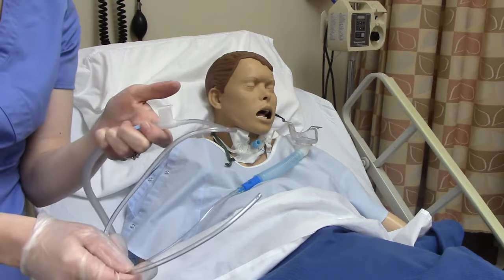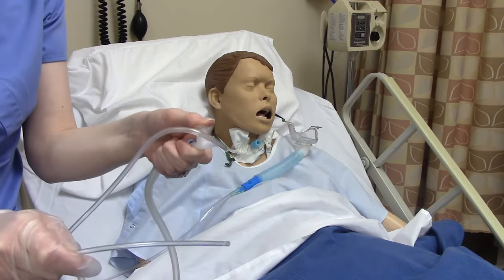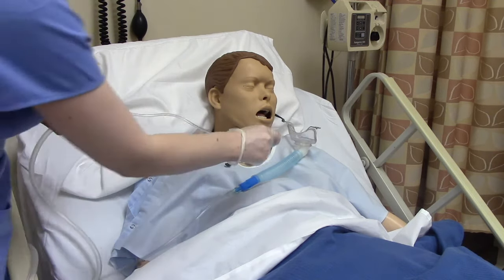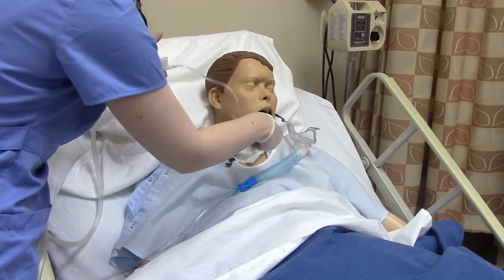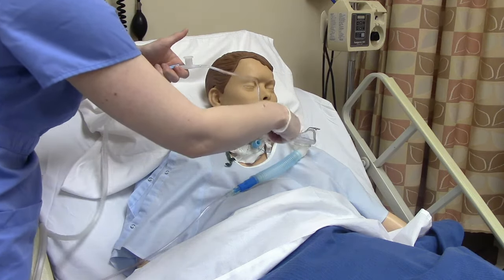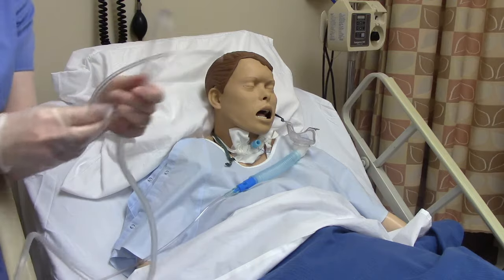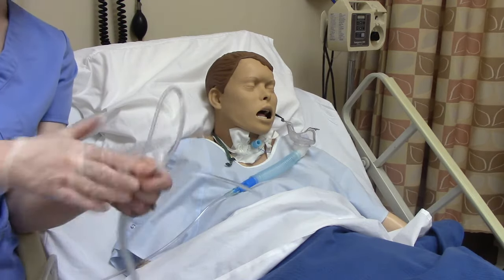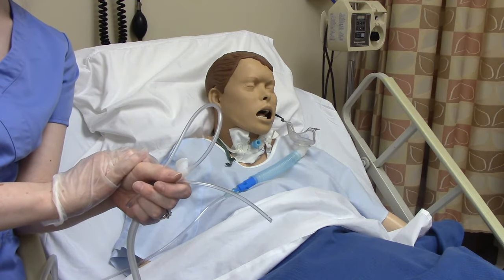In continuous suctioning, your finger is down the entire time you're removing. In intermittent suctioning, you apply and release as you withdraw. How do you know which to use? It should say in the provider's order whether this patient is to be continuously or intermittently suctioned.